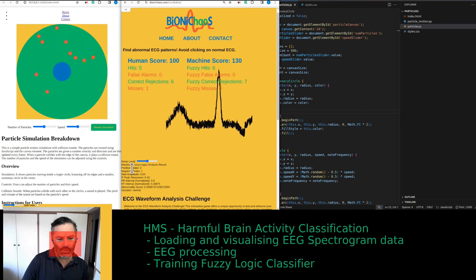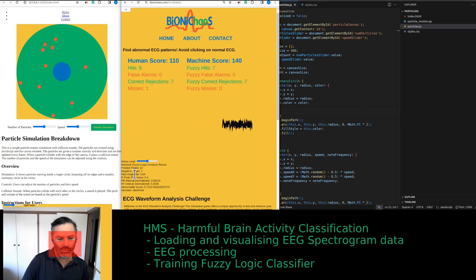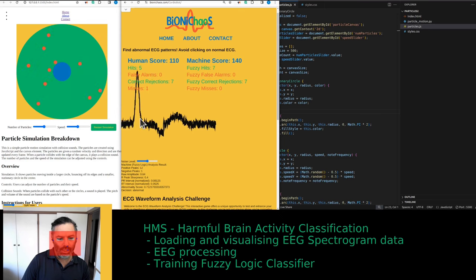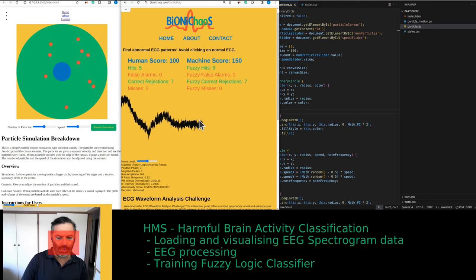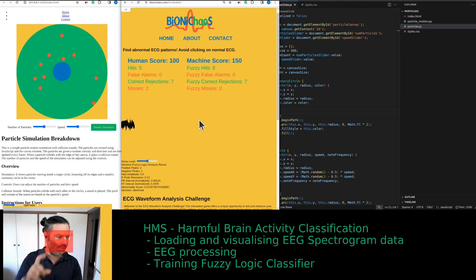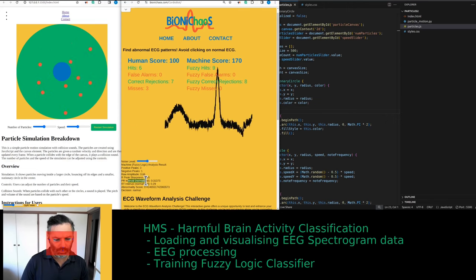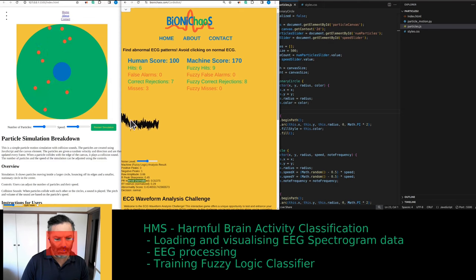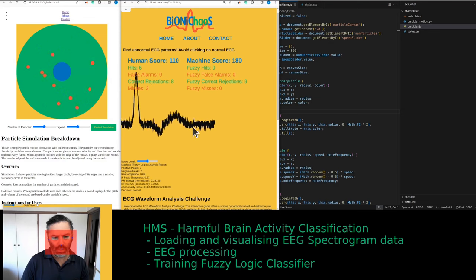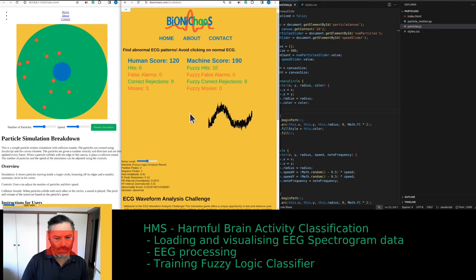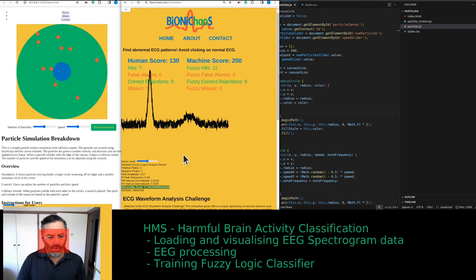It's a fuzzy logic algorithm looking at positive peaks, negative peaks, raw amplitude, and R-peak sharpness — essentially halfway through the R-peak, looking at the distance on the left and right. And it looks at the intervals between P and R, and R and T — so between the different peaks within the PQRST.